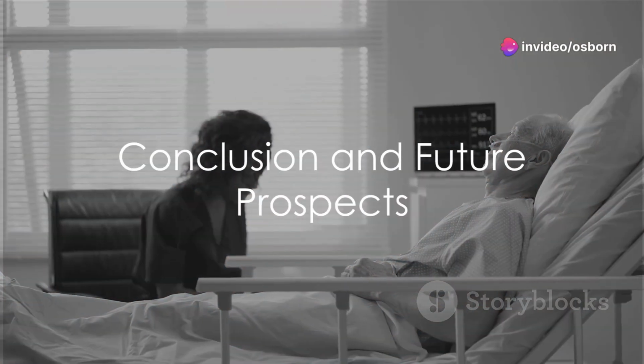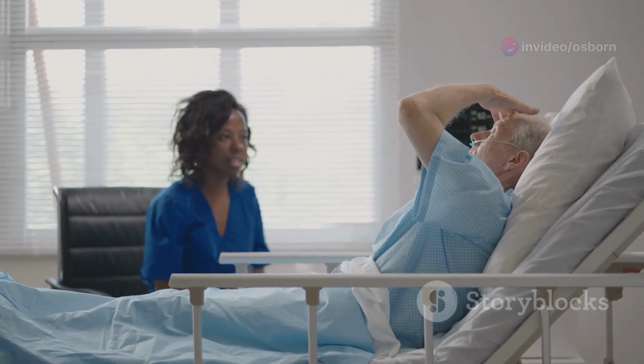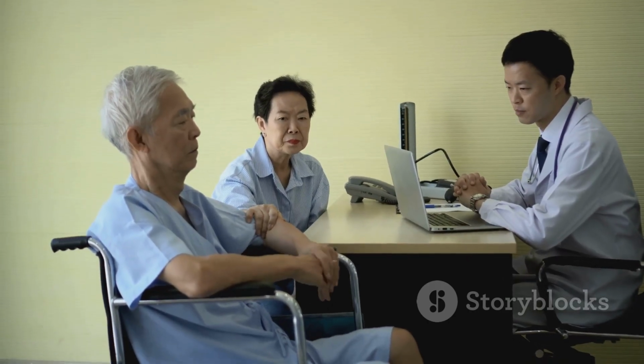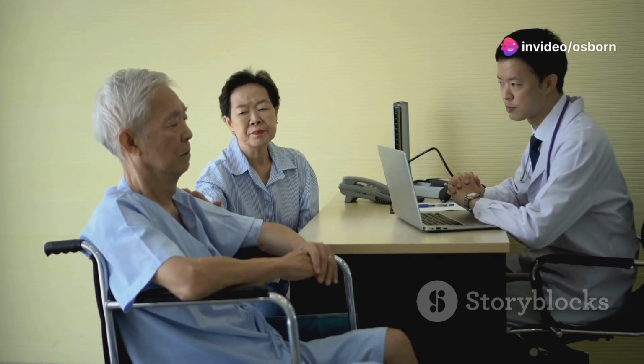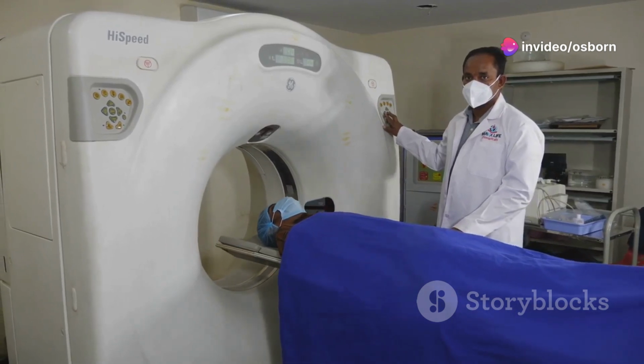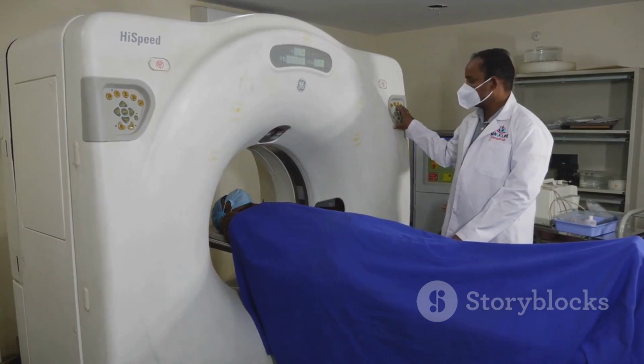Tissue-air ratio, TAR, like the PDD, depends on depth, beam energy, field size, and field shape, but is almost independent of SSD. TARs have traditionally been used for dose calculation involving low-energy beams, for example, cobalt-60, and isocentric beam geometry, for example, rotation therapy or stationary SAD techniques. Current methods of dose calculation use TPRs or TMRs, which have no limitation of beam energy and can be more accurately measured, to be discussed in Chapter 10. TARs for low-energy beams up to cobalt-60 can be measured directly or calculated from PDD.